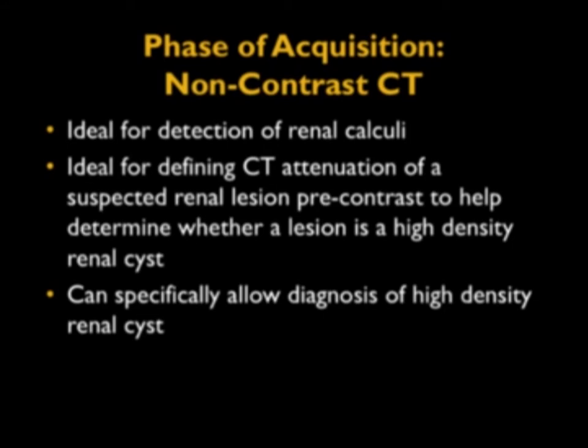I think in the ER setting, what worries me sometimes, and I'm careful of my reporting, is a patient comes with hematuria, the stone study is negative, the word of mouth is the patient has a normal CT, and the patient's discharged. We didn't say it's a normal CT. We said there are no stones present. It's very easy to miss the presence of a renal cancer on a non-contrast scan.